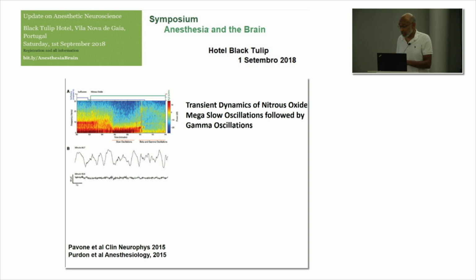It looked like a tsunami. And they're enormous. They look just like this. And you can see them here, right there. Then the thing that was interesting, they didn't last. They were there for about 6, 8 minutes, and then they disappeared. And you went to this sort of high-frequency oscillation pattern that you see over here, right?